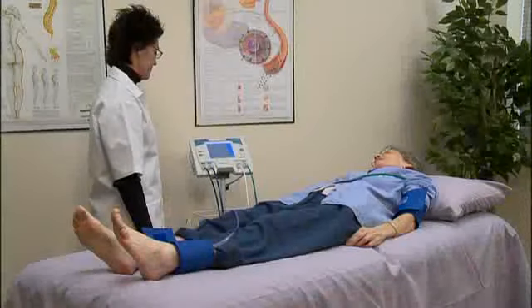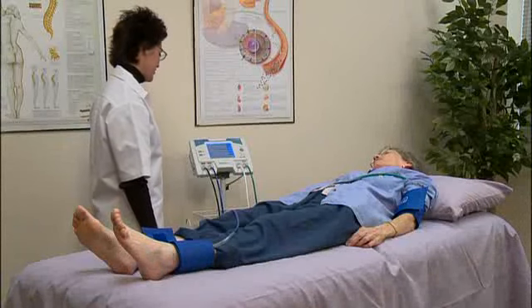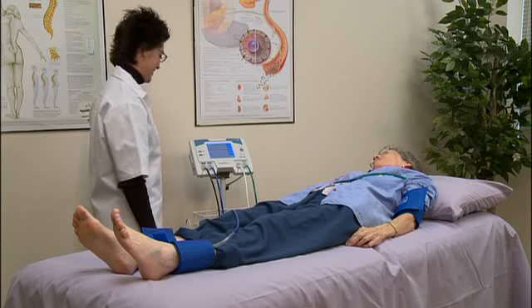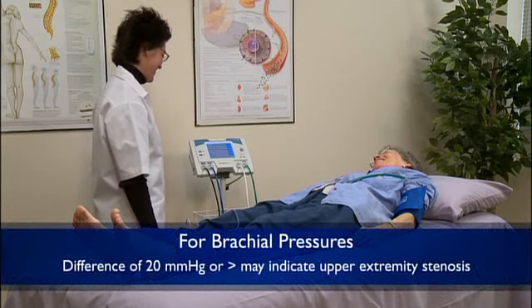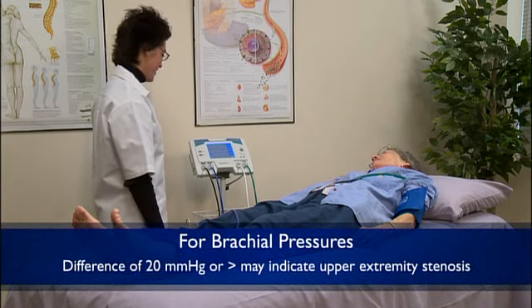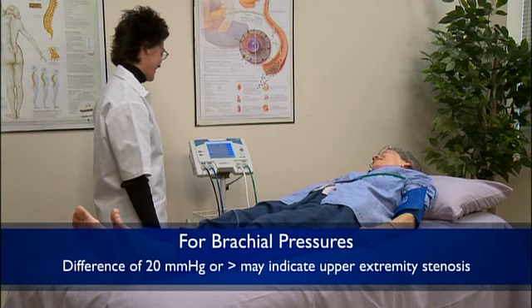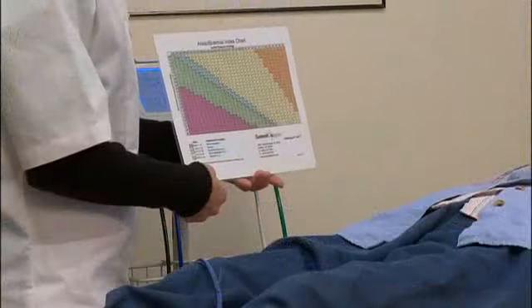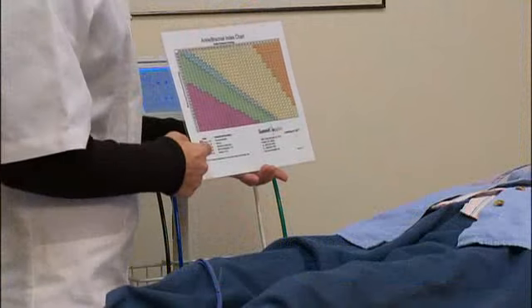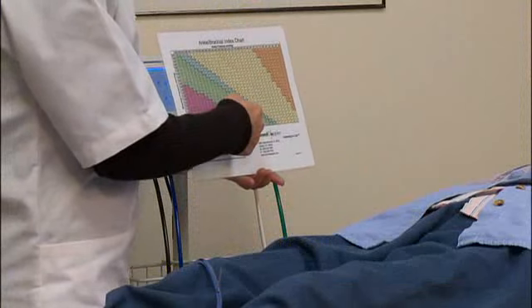The ABI calculation involved dividing each of the ankle pressures by the higher of the two brachial pressures to obtain the patient's right and left ABI. A difference of more than 20 millimeters of mercury between the right and left brachial pressures may indicate an upper extremity stenosis. If this occurs, verify the brachial pressure and consider further testing if the variance is repeated. The Vantage ABI quickly calculates the patient's ABI results automatically after the pressures are obtained by the cuffs.